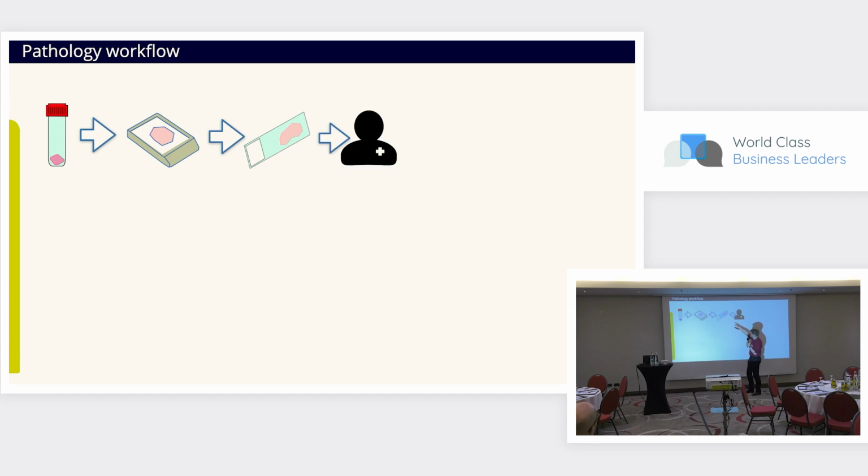And then this slide is being placed under a microscope, and an expert, a pathologist, will have a look at it, and will then write a report about that. Right, so stating, okay, I see these kinds of characteristics, and this is what I then finally conclude.